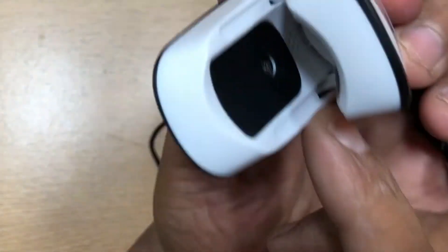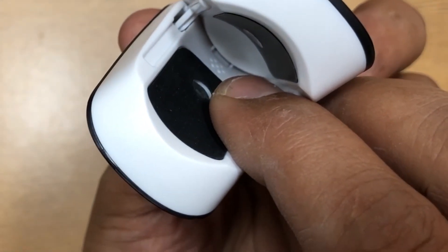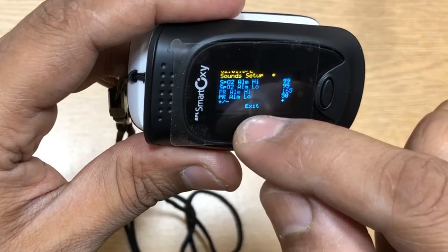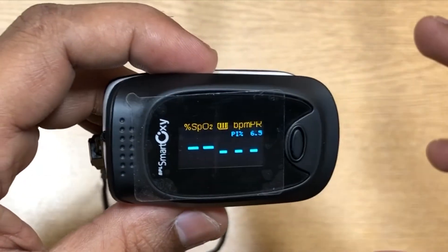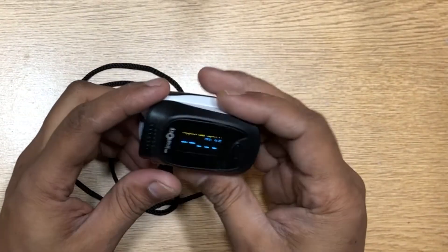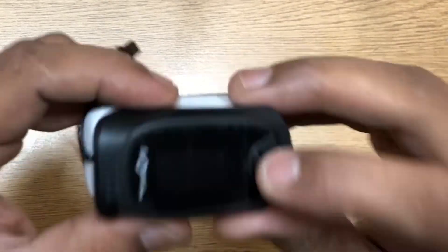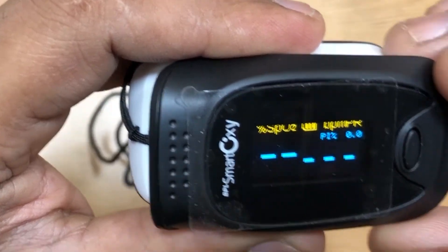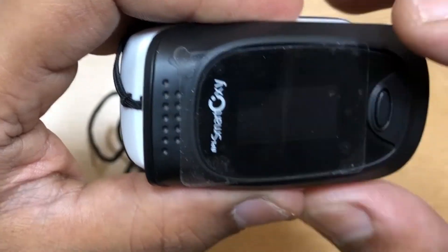Over here at the end you have a small beeper which is actually pretty loud — it will beep and inform you that the level has gone up or gone low, so that whoever is monitoring can come and administer whatever medication is needed. It's pretty efficient. In the six months my mom has been using it, the battery has not gone down at all — you can see it's still full. Very good battery life.